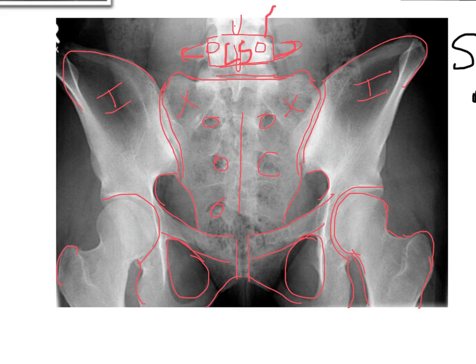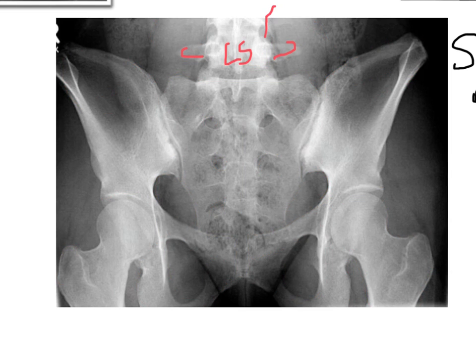Okay, your basic pelvic anatomy, as you are all well aware. We also have psoas muscles, or the shadow of the psoas muscles here. Now, another thing you will notice in this image, there are some densities in here that are obscuring or superimposing the pubis symphysis as well as the sacrum.